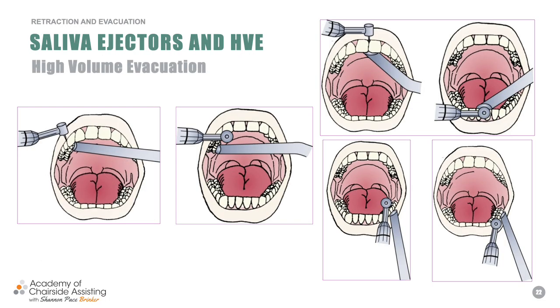So let's talk about those areas that we didn't go through. Again, on the facial side, let's talk about the canine area on the upper arch, okay? Regardless of whether you're on the upper right canine or the upper left canine, see here where my suction is? I'm right behind it, or really in that premolar area, which is safe. You could even go back to the first molar if you wanted to, just to familiarize yourself, but most importantly, get used to being in that area. But you can come forward.